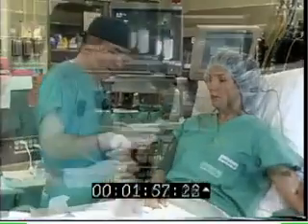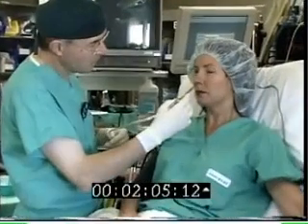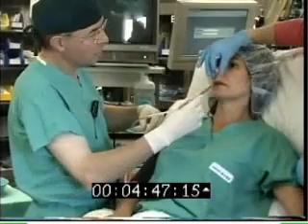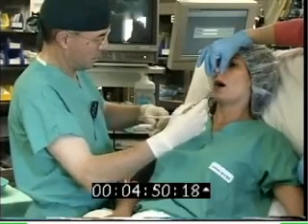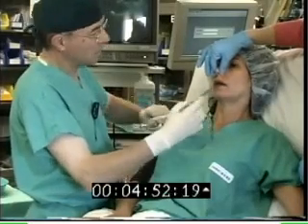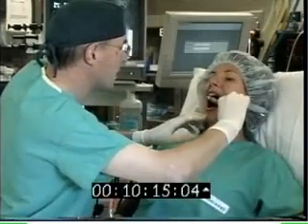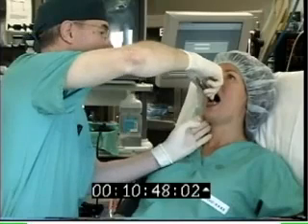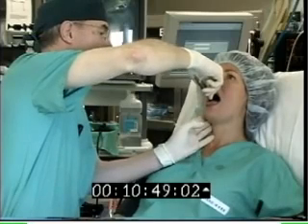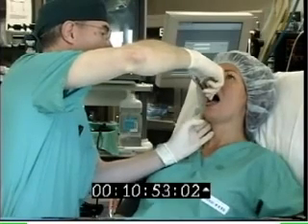The DeVilbis atomizer is applied with the patient breathing in a coordinated fashion as shown in this video. If an orotracheal intubation is anticipated, the DeVilbis atomizer should be applied through the oropharynx with the nose closed as shown. The intensity of the block can be supplemented with superior laryngeal nerve blocking using Jackson crossover forceps holding a cotton pledget soaked with 4% lidocaine solution.